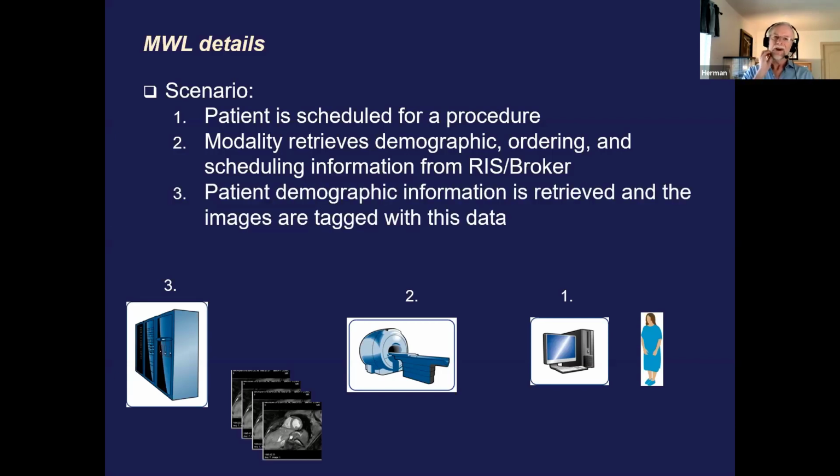So why is the modality worklist so important? Because the information part of the worklist is filled into the header. So now the header, with the images, comes to the PACS, and then the PACS says, oh, I have a problem. So to be able to trace it all the way back, okay, what is the information? What just provided a problem? Oh, maybe the accession number is incorrectly encoded or not present, or the referring physician is missing.